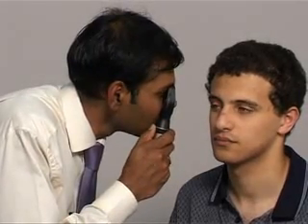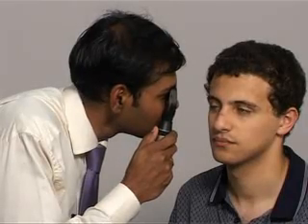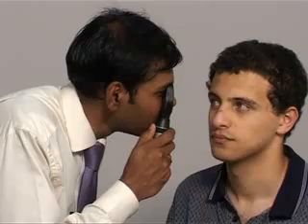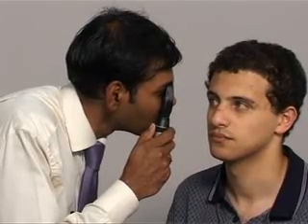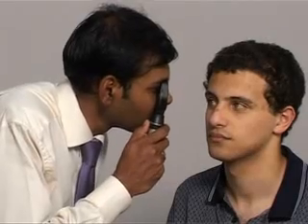After having done that, you could ask the patient to look directly into the light. Can you look into the light, please? And this brings the macula into sharp focus. Thank you. You may then want to repeat the same process for the other eye.